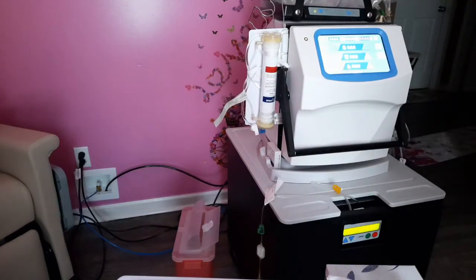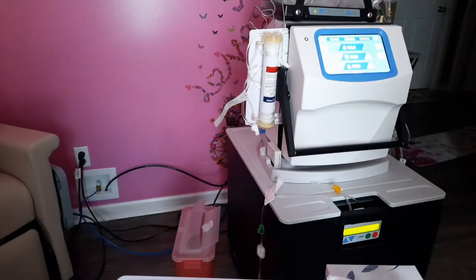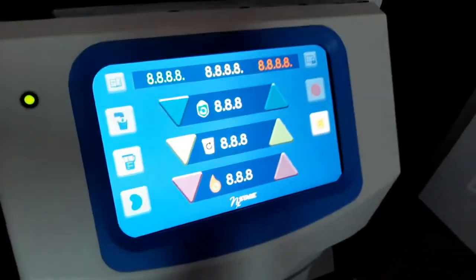All right. The machine is done priming. Let me get my sitting blood pressure in there. I got it in there. Take this cuff off and go to this machine. Okay, it gives you triple eights. So you hit the mute button. Let me get my glove.